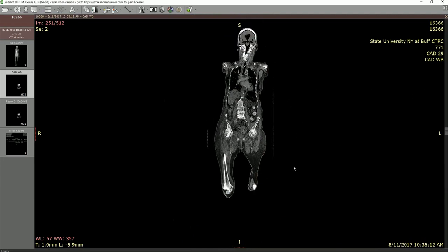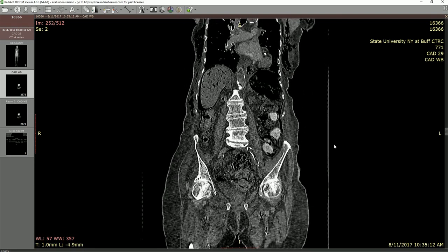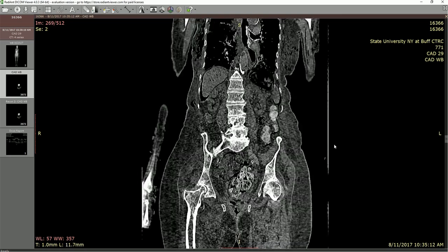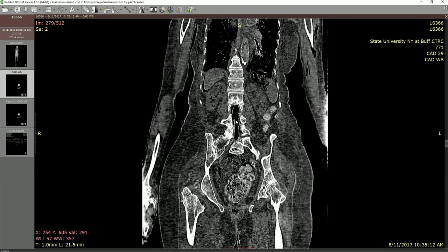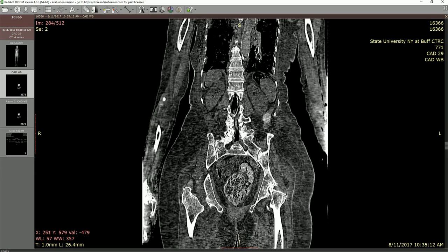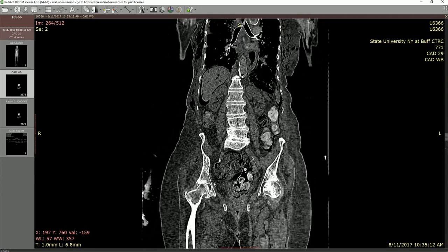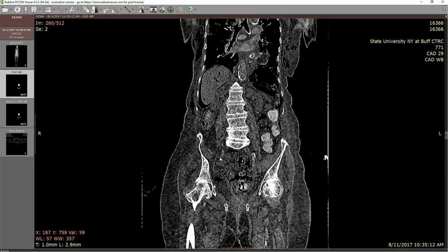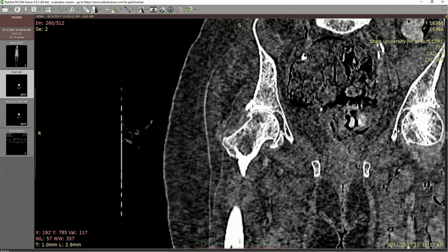Pressing Z then M to zoom in and move the view, scrolling from front to back, you can see the vertebral bodies giving way to the vertebral canal. A little bit of the cauda equina like we talked about. There's the sacroiliac joint once again. Moving back a little more anteriorly — there's the hip joint, and you can see the ligament to the head of the femur. Zooming in: this would be the round ligament to the head of the femur coming in at that angle.